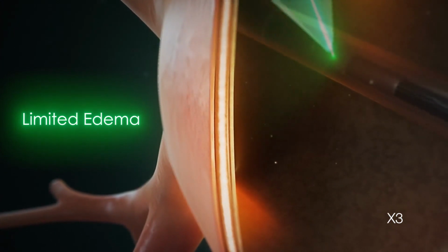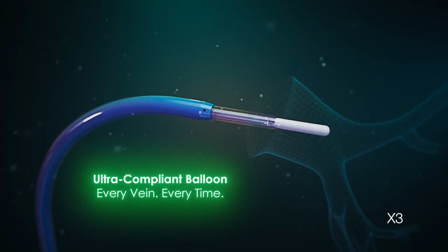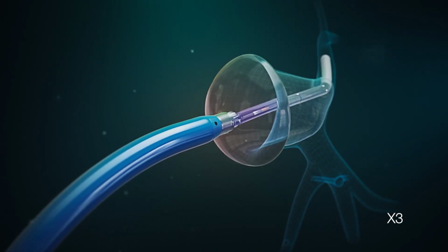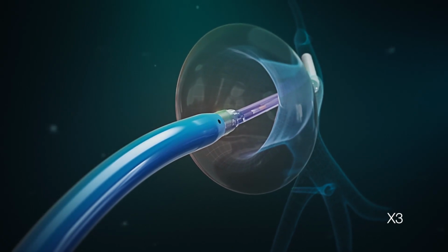Not so with laser. With laser, you need the balloon to get the blood out of the way to see what you're doing, but provided you can see the tissue, there's nothing you can do wrong. If you can see the tissue, you can make a lesion. It's always going to be a solid lesion. This is, for me, the single biggest benefit of laser.